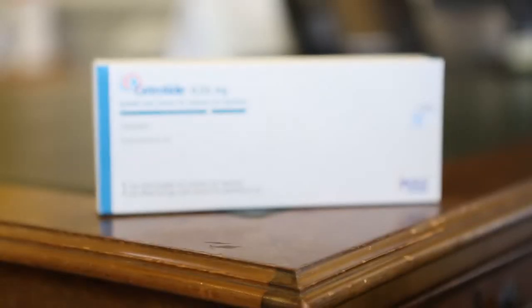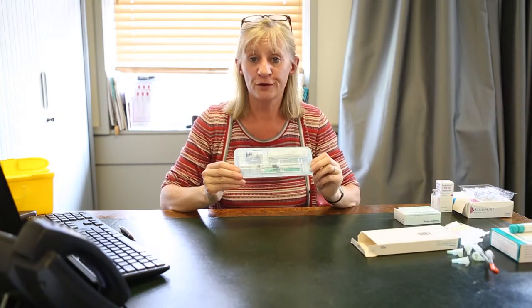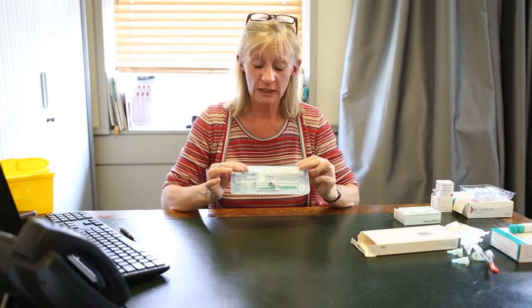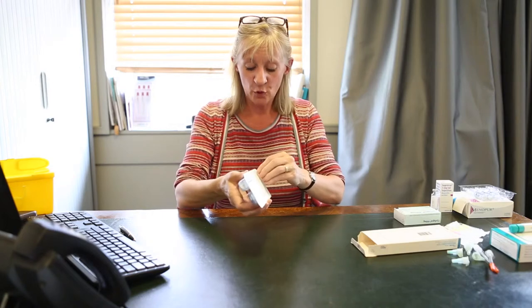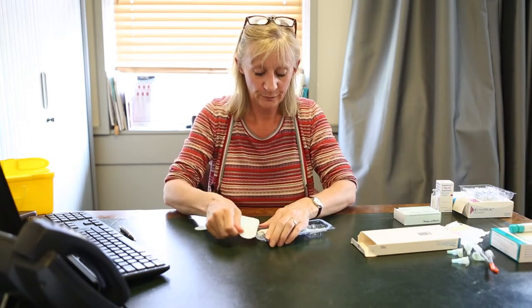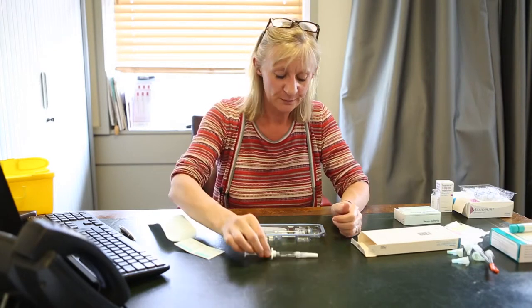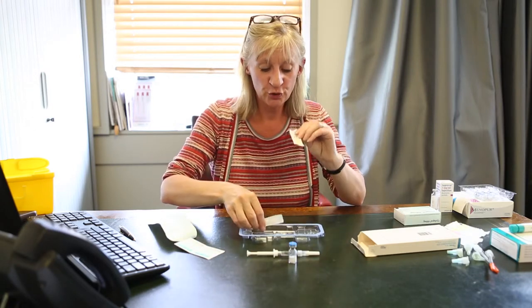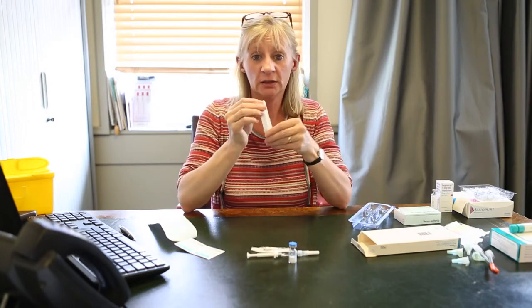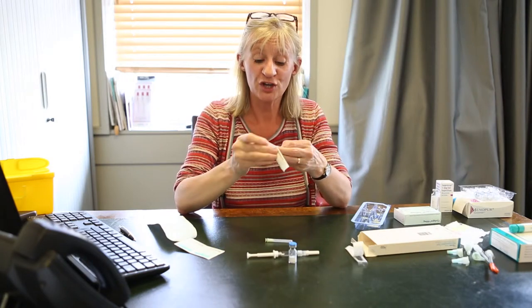I'm now going to teach you how to use Cetrotide. Cetrotide comes in boxes like this, and you're often given four or five of these boxes. Inside this box, there is a pre-filled syringe, there is a powder, and there are two needles: one large needle for drawing up and injecting the fluid, and one small needle for injection. Open up your pack and take out the contents. As I said, you have a pre-loaded syringe with fluid, one vial containing a powder which is the active ingredient, and two needles. The yellow needle is the larger needle and you will use it to inject the fluid into the powder. The smaller grey needle is what you'll be injecting yourself with.